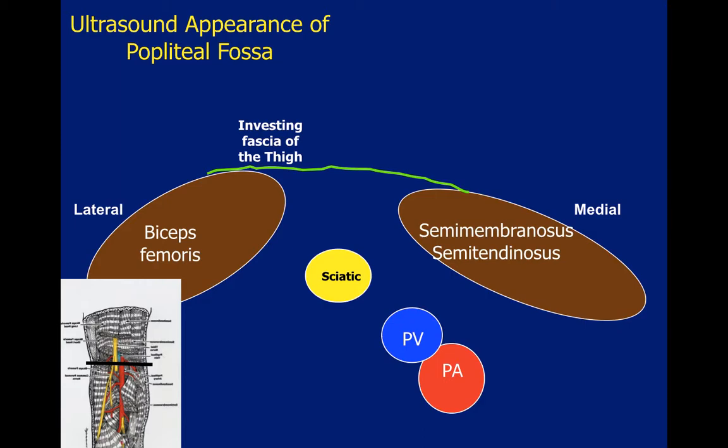A common approach to the sciatic nerve block in the popliteal fossa is to advance the injecting needle to a position in contact with or in immediate proximity to the nerve. This technique may cause painful paresthesias or even trauma to the nerve. An alternative to this method is to position the injecting needle medial to the nerve and inject local anesthetic into the fascial compartment containing the nerve.